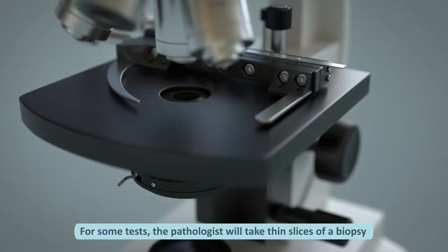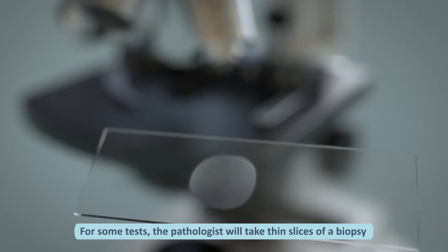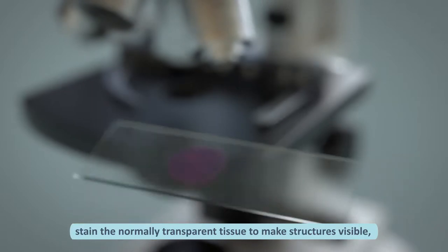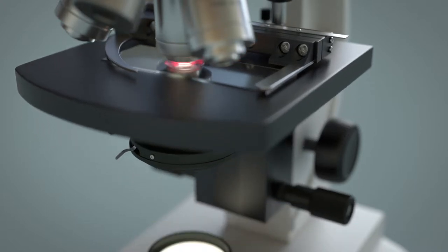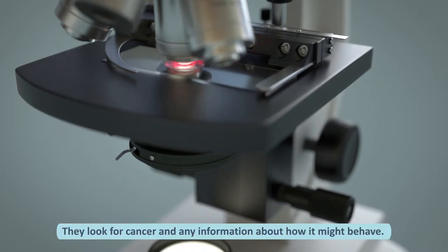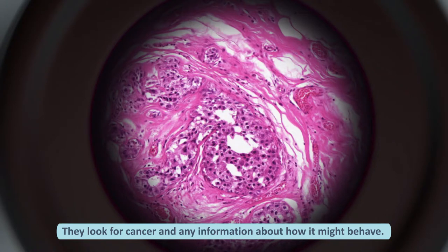For some tests the pathologist will take thin slices of a biopsy, stain the normally transparent tissue to make structures visible, and view them under a microscope. They look for cancer and any characteristics that can provide more information about how it might behave.